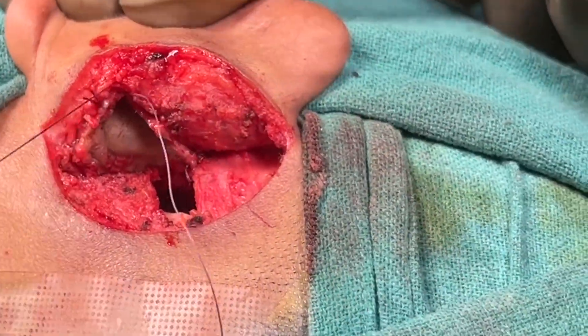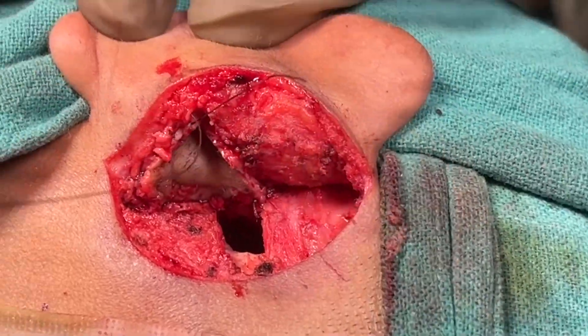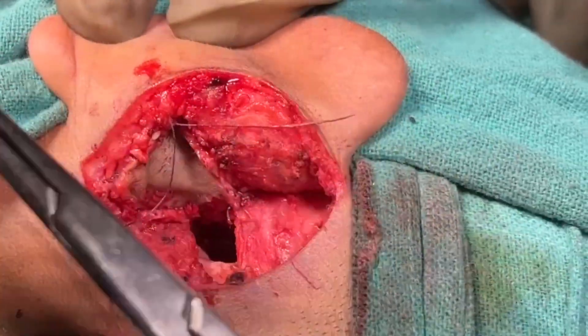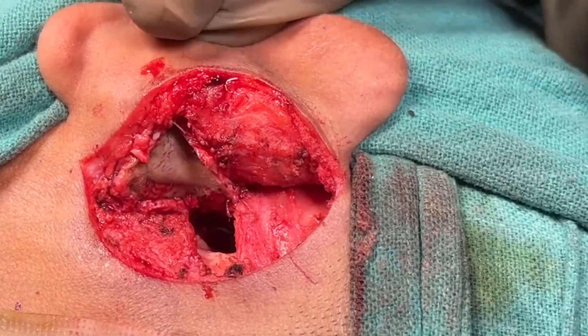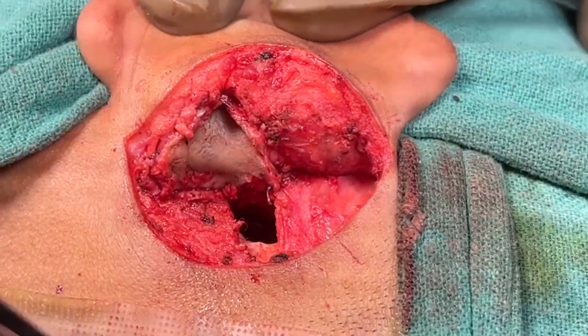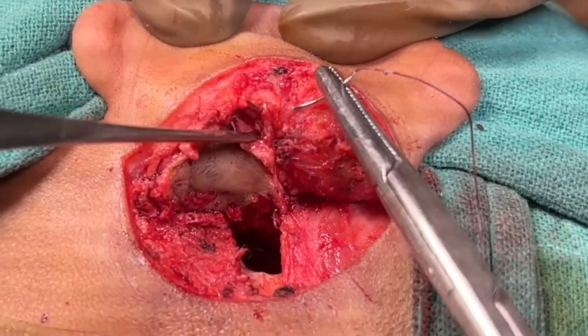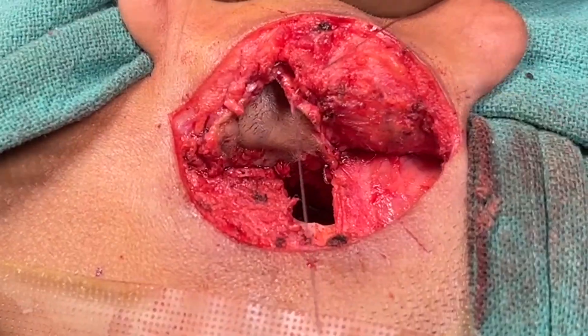The remaining portion of the concheal cartilage should not be exposed, so that there is no risk of perichondritis. I have completely covered the remaining concheal cartilage by suturing the skin to the soft tissue. This should be done nicely, and the cartilage should be completely covered by these sutures.